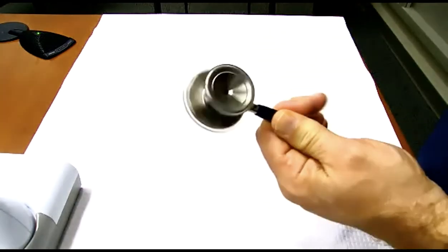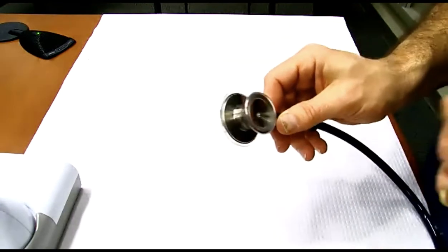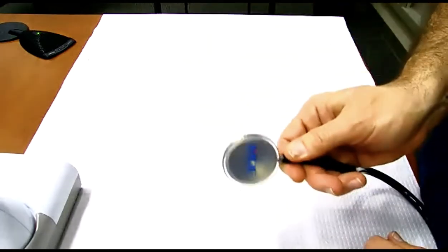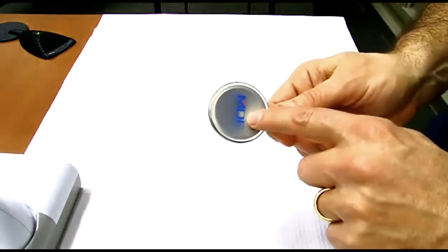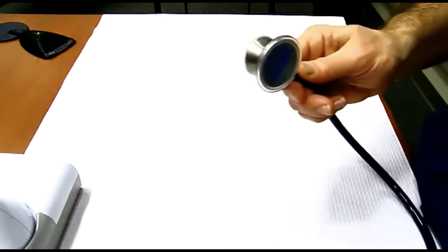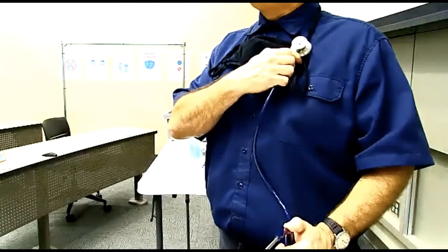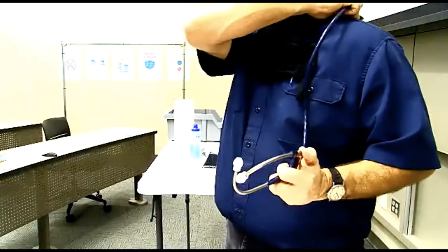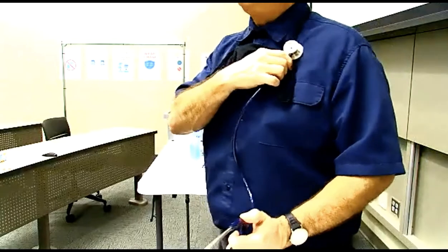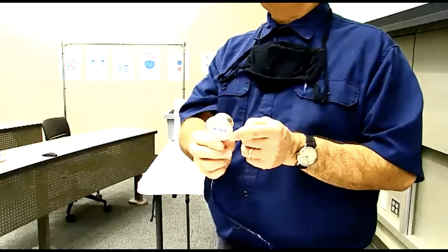Why do you want two different sides? Because it turns out the stethoscope conducts sound slightly differently depending on whether it's a high frequency or a low frequency sound. The diaphragm, this wider part here, works best for high frequency sounds. What is a high frequency sound? A high frequency sound is when the doctor puts this on your chest and says, breathe in. And they put it on your back. Breathe. Breath sounds and lung sounds, when you're listening to the lungs, those work best with the diaphragm because it's a high frequency sound, all right?